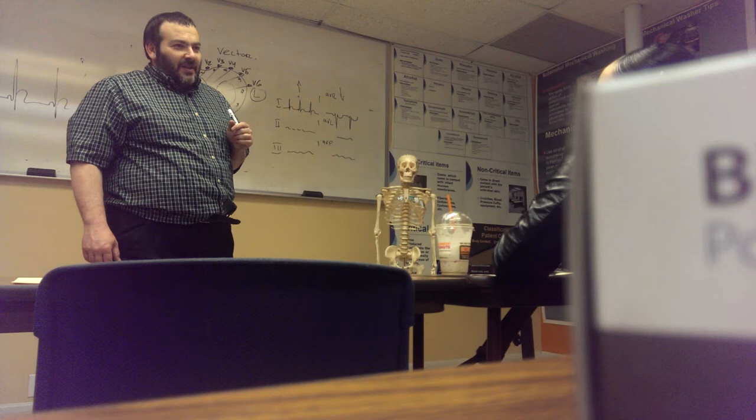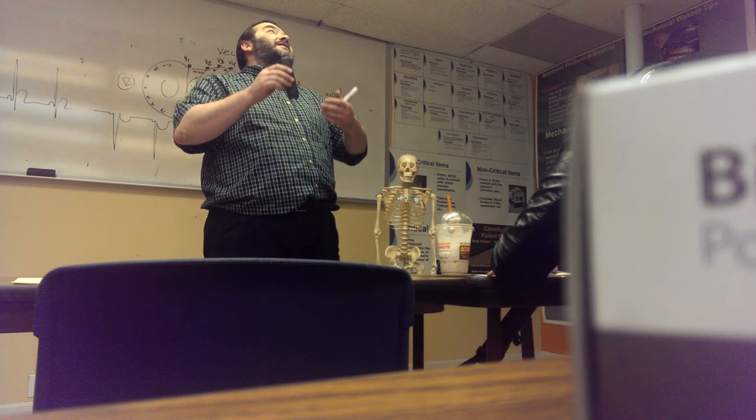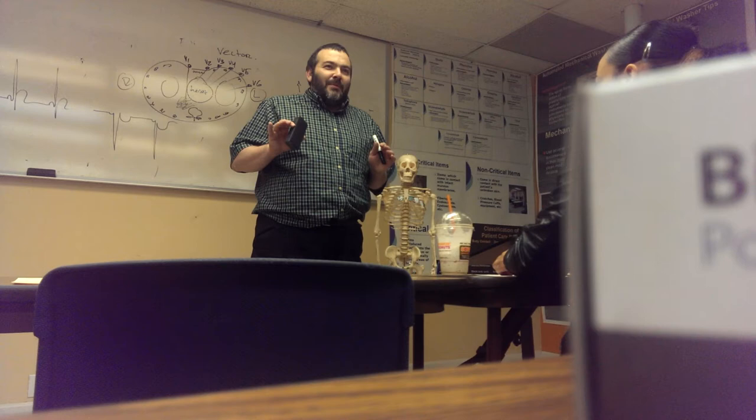Please remember that, because that is one of the most common mistakes that we make in the field. Accidentally putting right on left and left on right, because sometimes it just gets confusing. Even simple things like left and right get screwed up, especially if you're dealing with a stressful situation. Oh my God, I thought it said right. Okay, it happened.